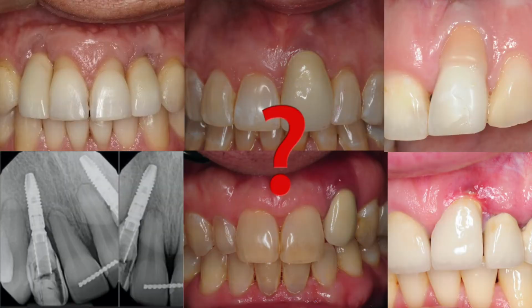So here we are. These are several different patients with recession around implants. There are all kinds of different ways and shapes that they come in, and we see this quite frequently in the aesthetic zone. It happens quite often, maybe too often. So I think the question is, what are the treatment options?